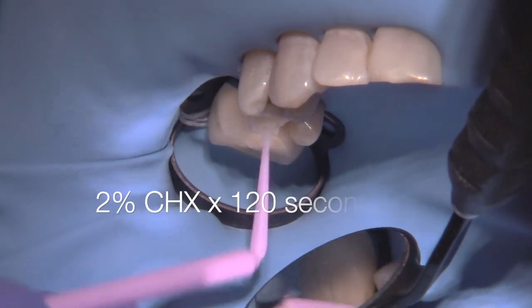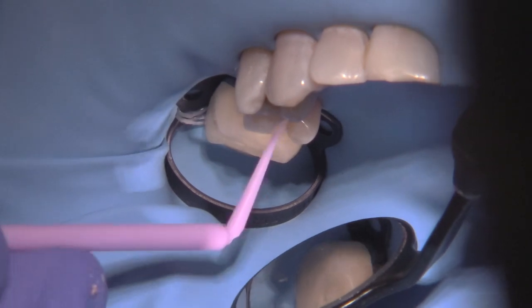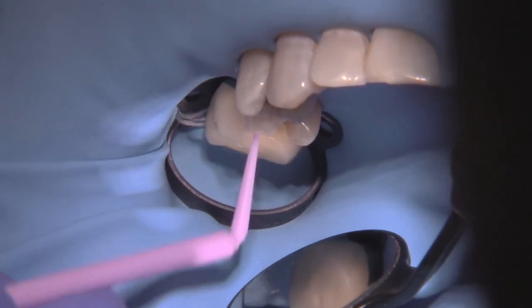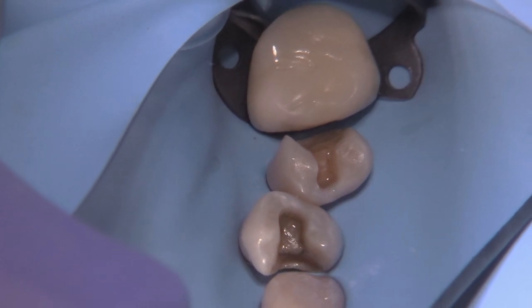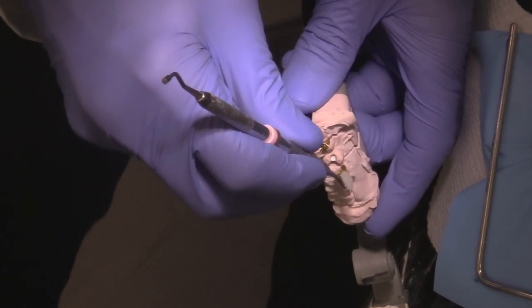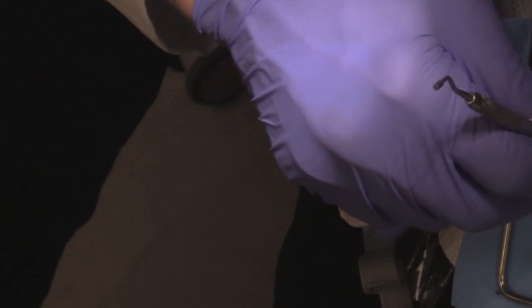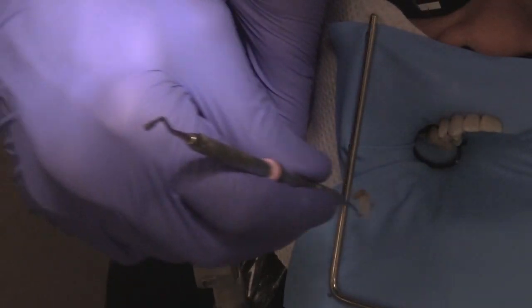Let's get these inlays seated. We're going to use a two percent chlorhexidine for two minutes on both of the preparations under rubber dam isolation. This is going to help reduce bacterial numbers and provide the patient with more comfort after they're cemented. I like to put a little wax on the inlays and carry it to the mouth with a condenser in the same orientation.